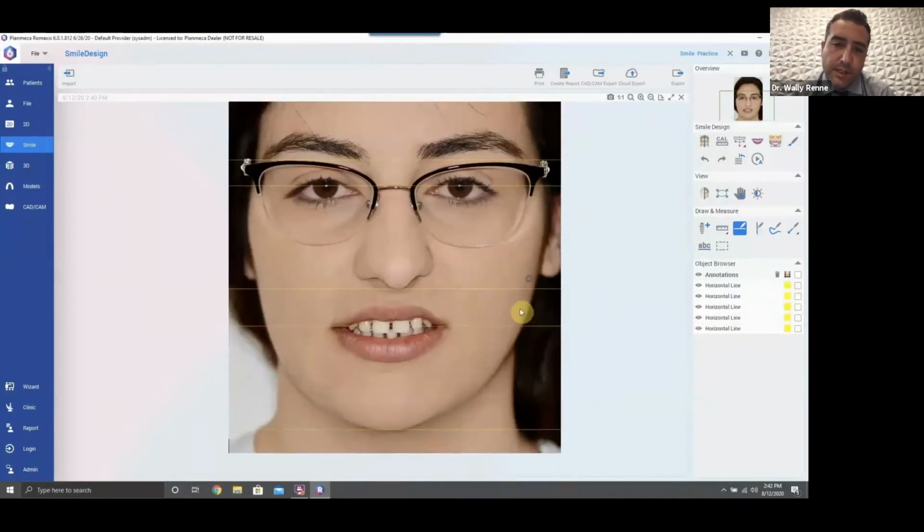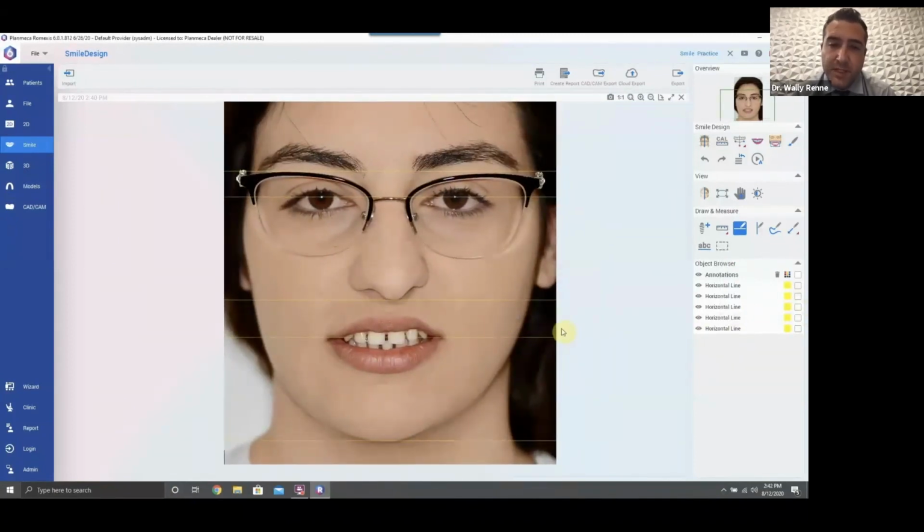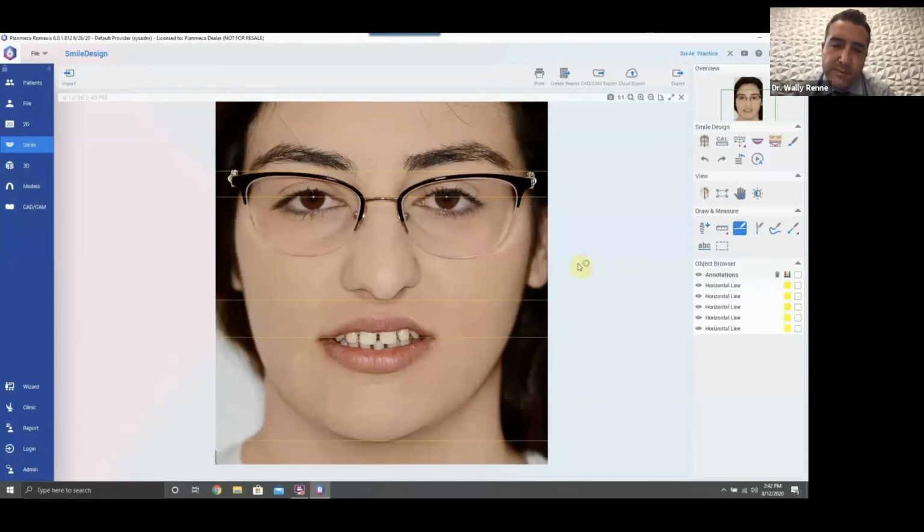The first thing that I wanna know when I'm doing measurements of my patient is, why do they have a toothy repose? You know, is it vertical maxillary excess due to excessive downgrowth of the maxilla? Is that why they have a toothy smile? I don't know. So we need to figure this out.